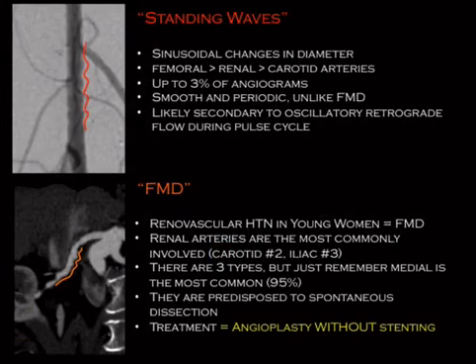Right there. So if you haven't done angiography, which most people haven't, this is a thing that happens not infrequently. About 3% of the time on angiograms you'll see it. It's called standing waves, which is basically just oscillations and pulsations of flow that you're imaging real time. It tends to affect the femoral artery the most. You can see it in the renals or the carotids. If they're going to show it, they're going to probably show it in femoral, because it's easier to see like that. They're smooth. It's a periodic thing.